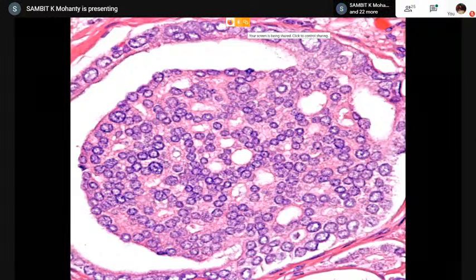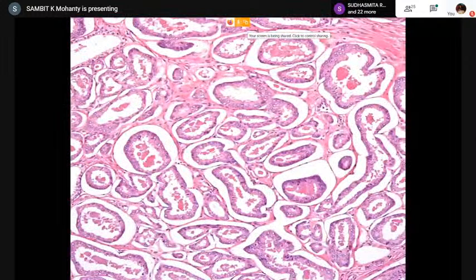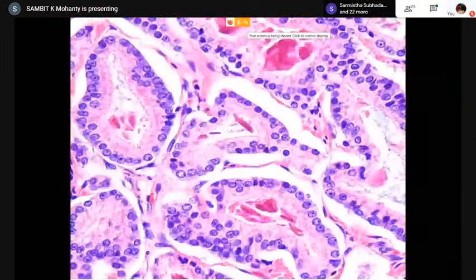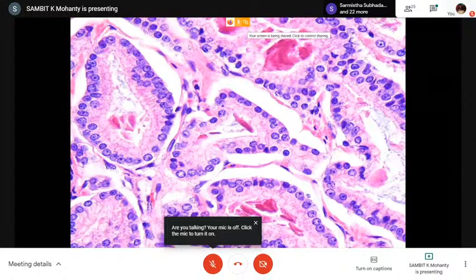This is a glomerulation again. It looks like a glomerular tuft with some afferent and efferent arteriole, and this is within another tuft. How about this? These are the eosinophilic crystalloids, and usually eosinophilic crystalloids have a purplish exterior, and these are the glands. And these are again eosinophilic crystalloids.